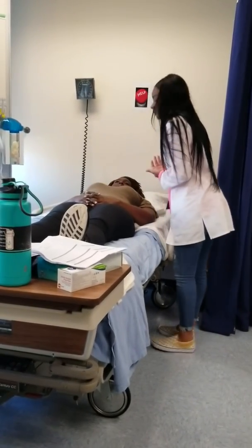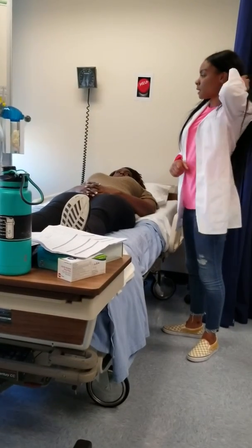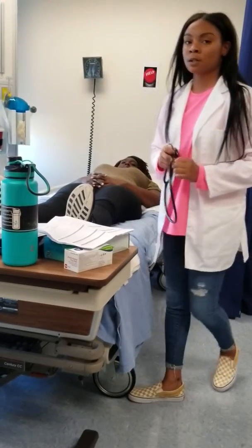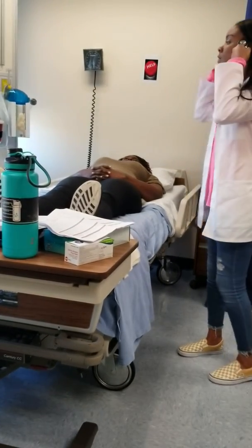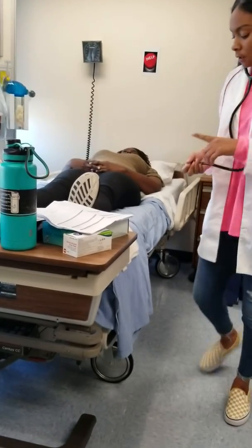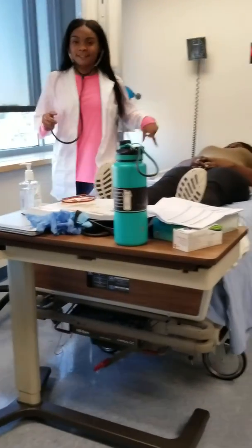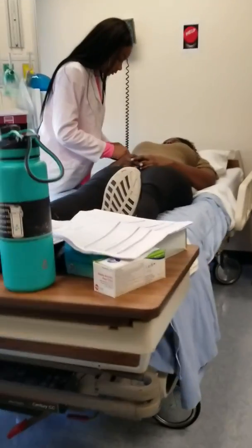Looks great. When inspecting the abdomen, the next step is auscultation because you don't want to disturb the bowel sounds by palpating or percussing. So I'm going to start in the right lower quadrant and assess for bowel sounds.